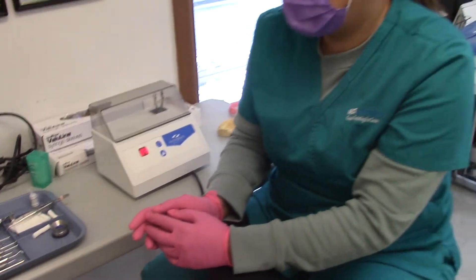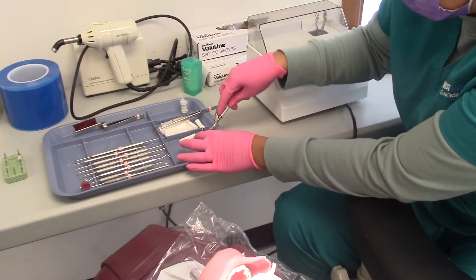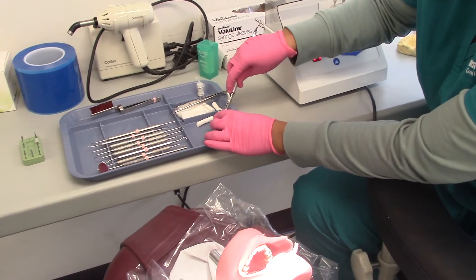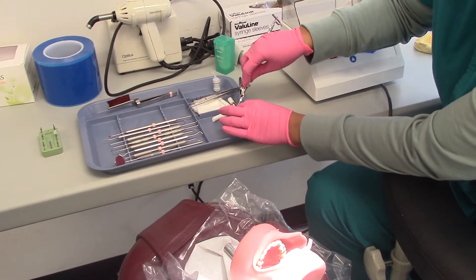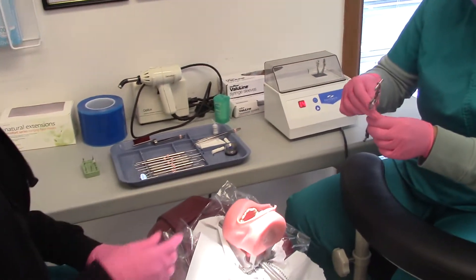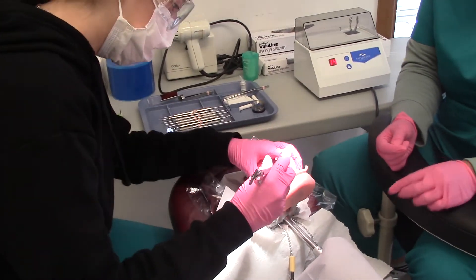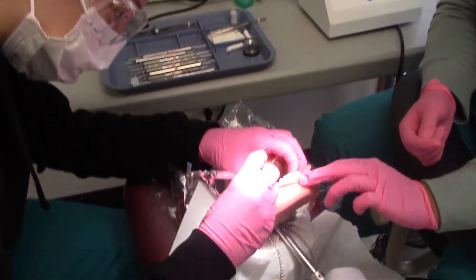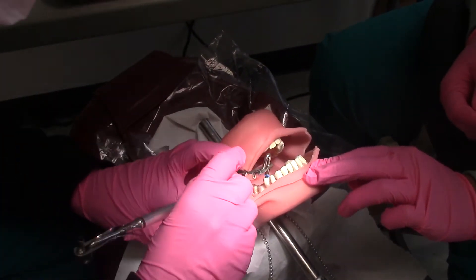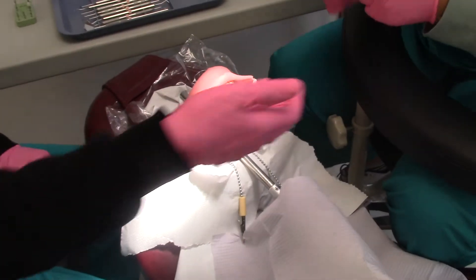Now Kaitlyn is going to load the amalgam carrier and hand it to the dentist. Hand that back to the dentist — this is the assumption that we're going to do.